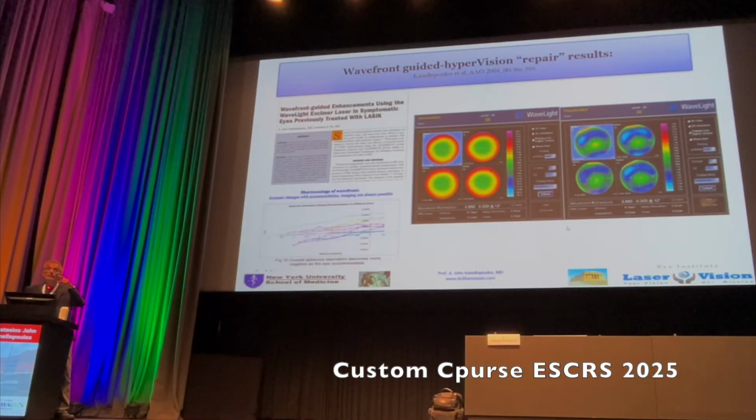We talked a little bit before about line of vision, and thanks for that question. This is the wavefront studied dynamically in patients back when we thought wavefront-guided treatments are the golden bullet for refractive surgery, showing that your wavefront is dynamic. You don't have a steady, stable wavefront when you're using your vision. It depends where you're focusing, what are you focusing on, if you're following something, if you're fixating on something.